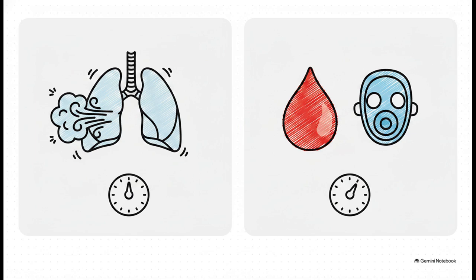Now, on the flip side, you have oxygenation. This is all about ensuring life-sustaining oxygen actually gets delivered to the tissues. Got a severe pneumonia patient struggling for air? This is where you look. If oxygenation is the issue, you adjust your FiO2, which is the fraction of inspired oxygen, and your PEEP, the positive end expiratory pressure that essentially stents those tiny alveoli open. Just keep these 2 distinct pathways clear in your head, and you're always going to know which dial to turn.